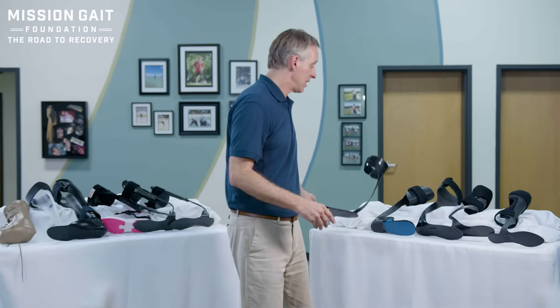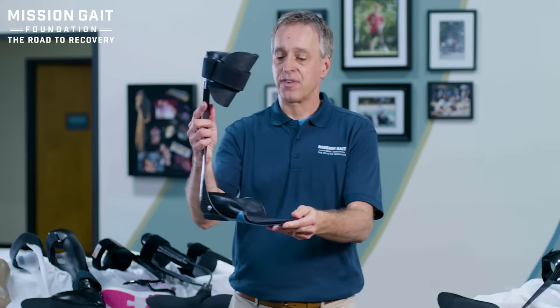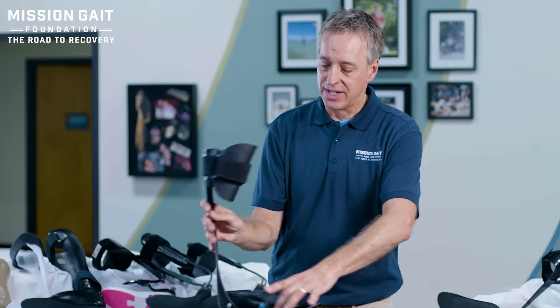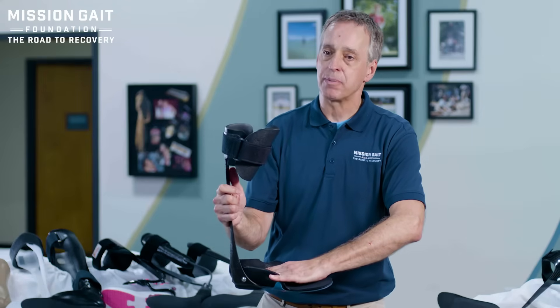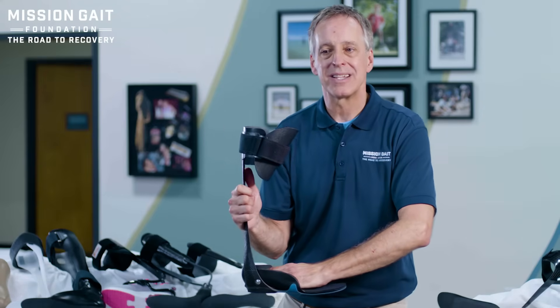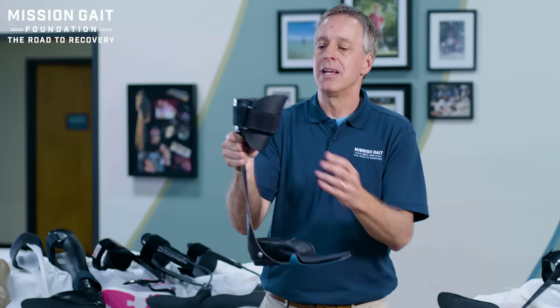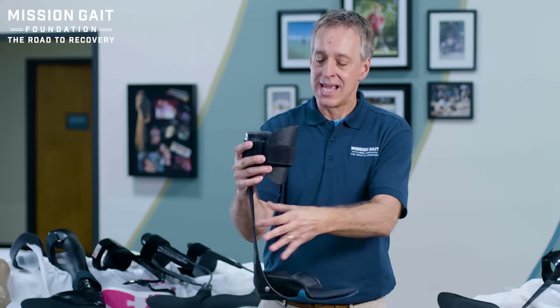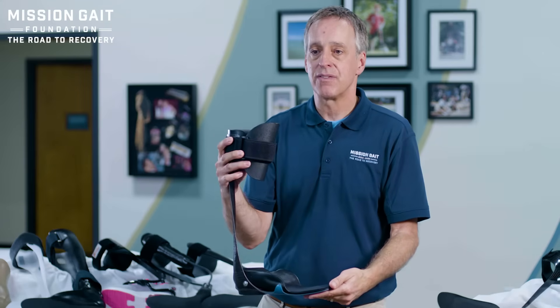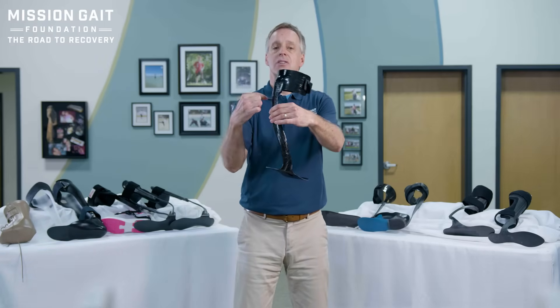On the topic of custom versus non-custom, one other option here looks similar at first glance but has a cupped mechanism around the foot. This cup mechanism is custom made to stabilize the person's foot, give them stability, and keep that foot moving straight forward. It still bends the same way and gives you energy back, but a larger cuff at the top really stabilizes and holds that shin in place. It's custom made to the individual and can work very, very well.